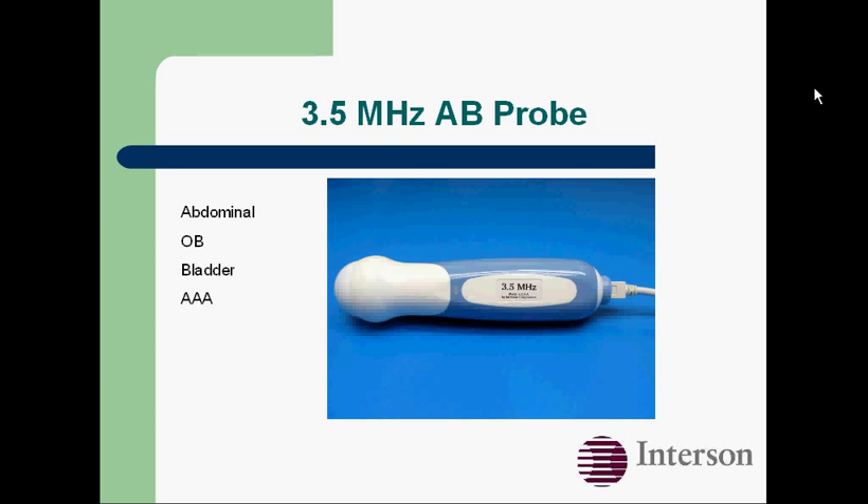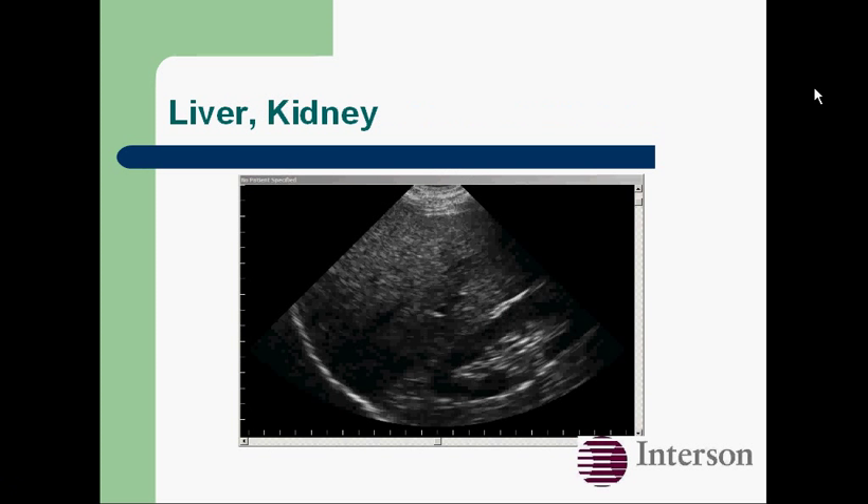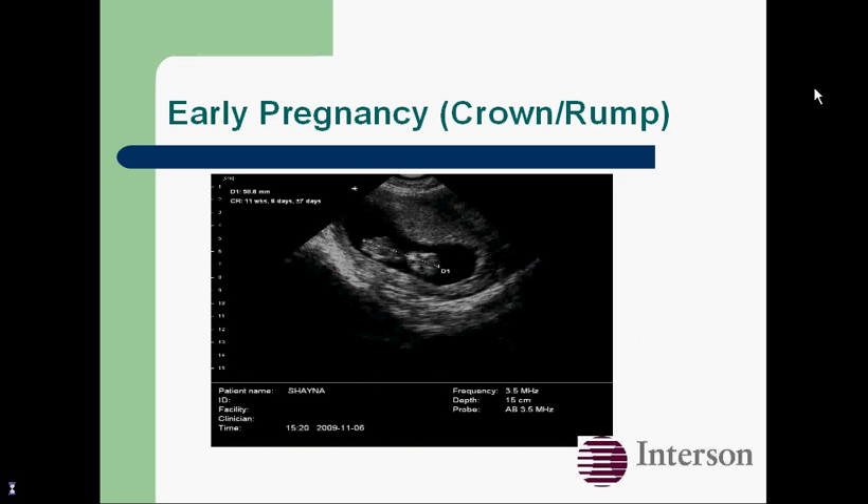Here's our 3.5 MHz abdominal probe, optimized for abdominal, OB, bladder, and AAA scanning. Here's a transverse view of the bladder, and our built-in calculation software will calculate residual bladder volume. Here's the liver and kidney. And here's an early pregnancy — our built-in OB calculation software will display gestational age.